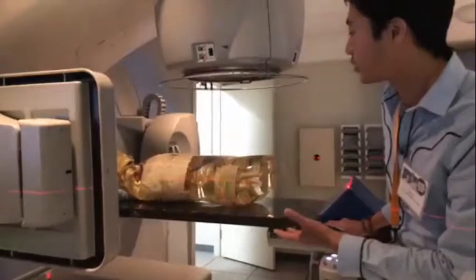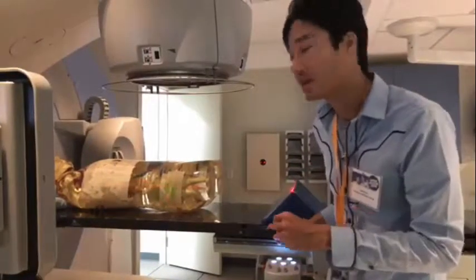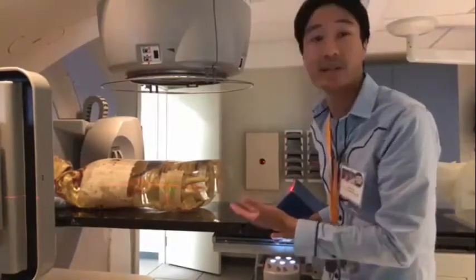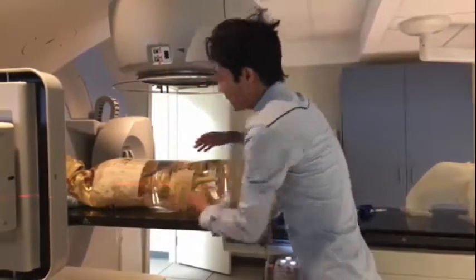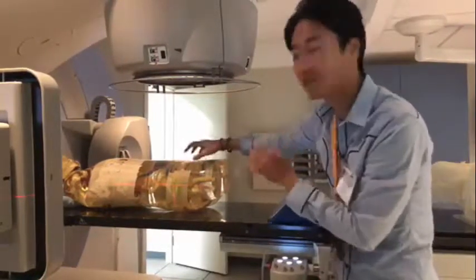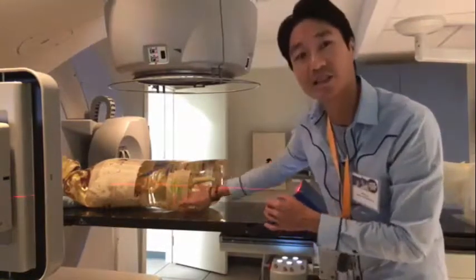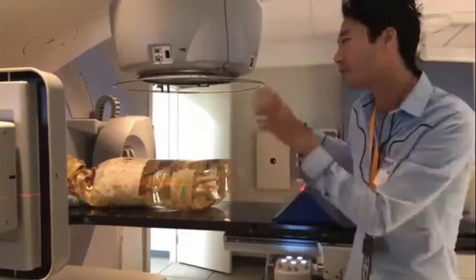So this area is where we deliver the treatment, but there's other areas where we actually plan the treatment, where before this patient got here, they actually got a CT simulation where we basically took CT scans of exactly where their prostate, let's say we're treating the prostate cancer, is. And then after, we would actually make a plan so that we're treating the prostate with the dose that we want them to have, while the normal tissue does not get dosed, like the rectum and also the bladder. So that's pretty much one of our environments.